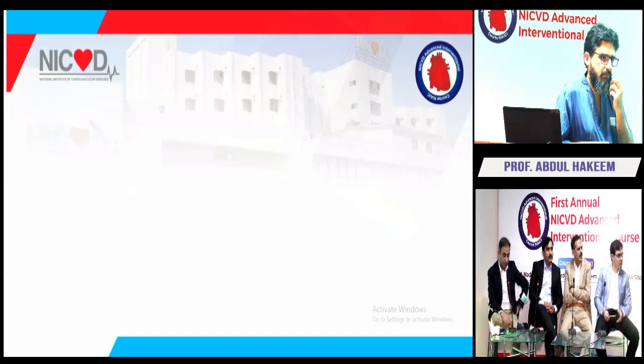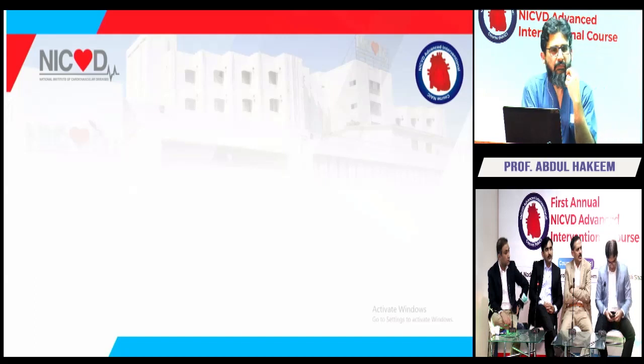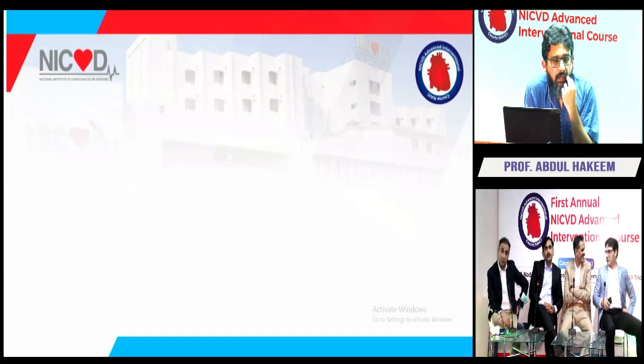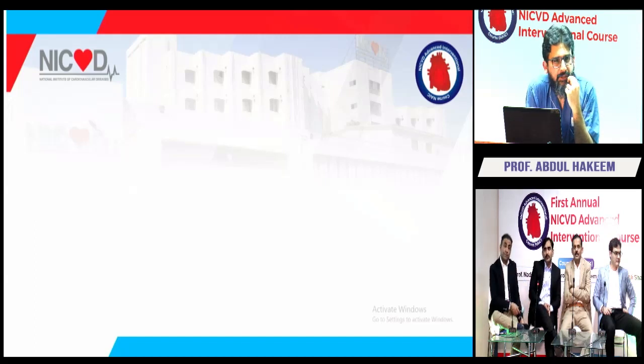Sir, whenever we are doing such calcified cases and we are taking the perimeter measurement, should we include the calcium inside and take an oversized valve in these cases? No, that's a good question actually. You always would, the border would be outside the calcium. You don't go on the inner aspect of the calcium, because understand that that calcium is what the valve is going to abut.